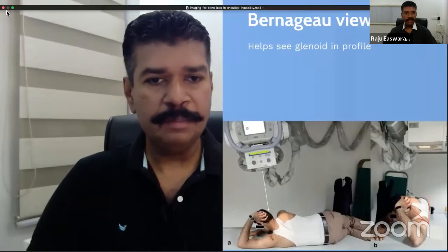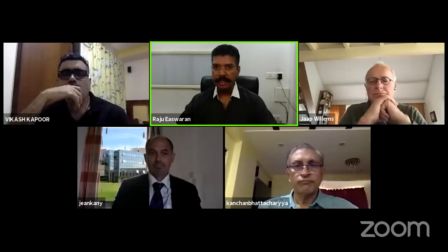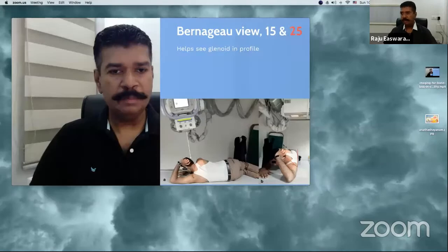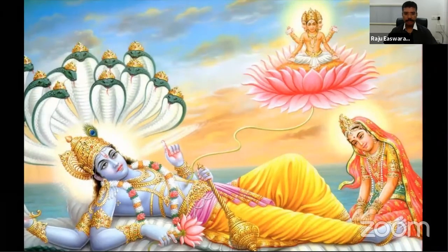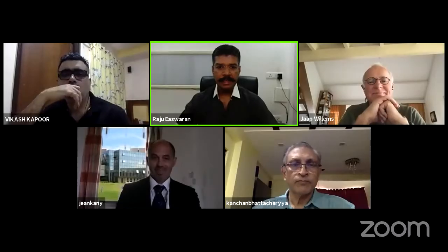So I'll interrupt here, and one easy way to remember the Bernageau view positioning, I'll just share my desktop, is if any one of you has visited my hometown Trivandrum and the Padmanabhaswamy temple, you would see Lord Vishnu in this particular pose, known as the Ananta Shayanam. And that is perhaps the best way to remember how to do a good Bernageau view. So if you are able to position the patient in this posture, which is generally comfortable to most instability patients, they will tolerate it well. So I'll now reshare the presentation and go.